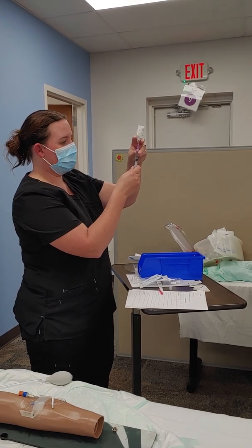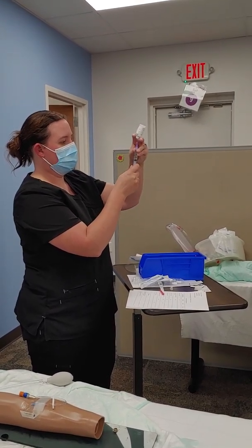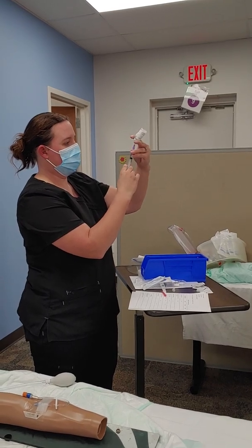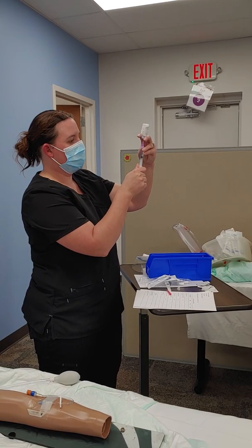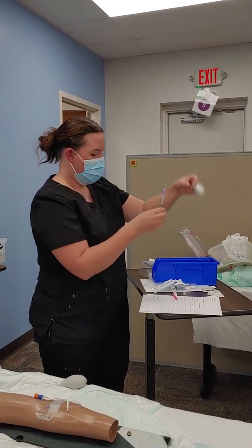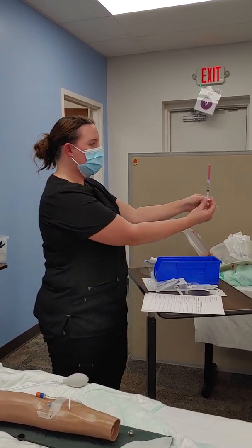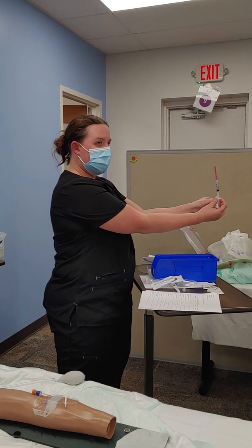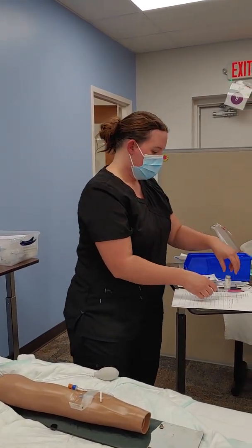Get rid of my bubbles. I have 2 milliliters of my medication. I'm going to safely recap, showing my instructor that I drew up the correct med and it's the correct dose. They agree.